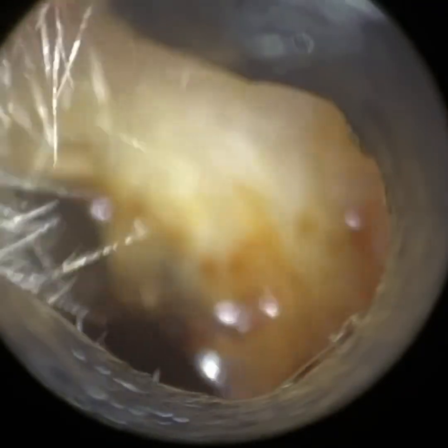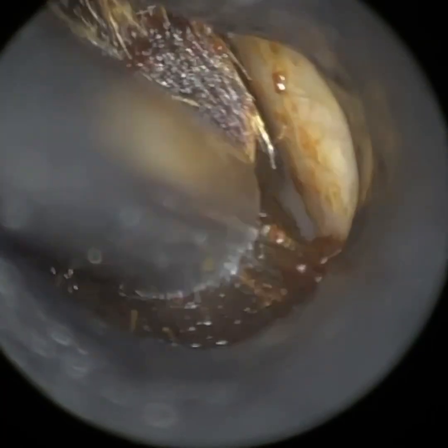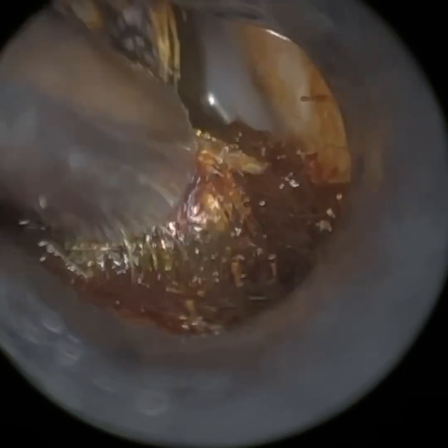I'm just trying to get in and behind this, and the earhook is actually just dissecting through the matted wax. I've just put some olive oil in there just to change the consistency, and you'll see this will just help loosen this plug. We're coming from the bottom, just lifting this up. It has attached itself to the canal wall, so we're just going to mobilize it.